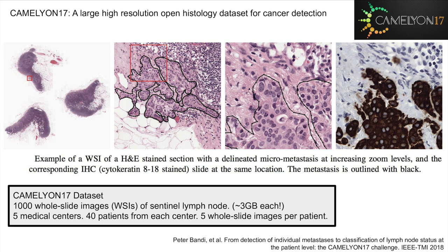Histology imaging involves tissue samples which have been sliced and imaged using a microscope. Typically, whole slide imaging is where an entire slide is imaged by stitching together multiple smaller images obtained while moving the microscope objective over the entire slide at a high magnification.